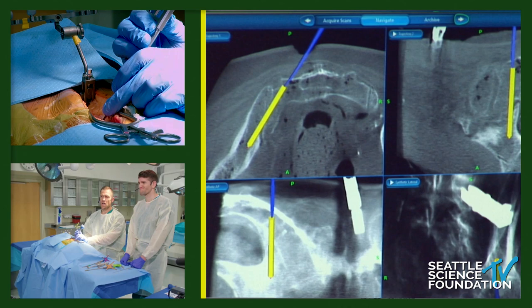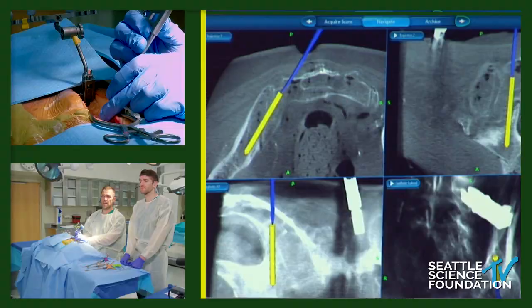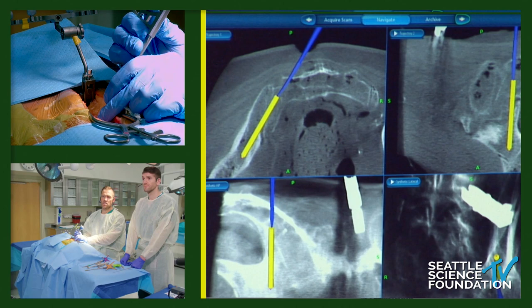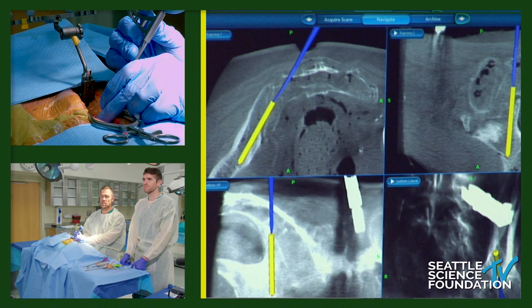This cadaver has pretty non-dense bone. Typically I get a starting point with a mallet, but here I can advance by hand. Our control, especially in dense bone, is much better with the mallet. With a navigated gear shift, I gently tap it forward. In the navigation, the yellow is the projected trajectory of the screw and the blue is the actual instrument. I'm now within the sacrum at the S2 ala starting point, advancing towards the SI joint, maintaining that trajectory across all the projection views.